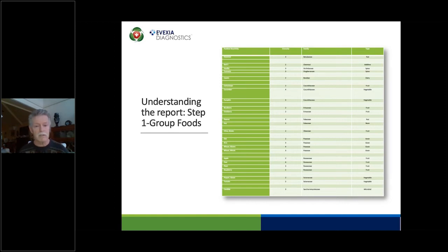And what you'll see universally, I mean virtually across the board, is that a person will take an initial test, they'll test very high positives to certain foods, and they'll also have a lot of symptoms. 10 months, 12 months later, you retest them. What you'll see is the foods in those categories have gone from a 4 to a 2, a 3 to a 1, or a 2 to a negative. So what you see over time is antibodies have a half-life of about 3 to 4 weeks. So antibodies go away as long as you go through the elimination diet and remove the food. So out there 10, 12 months, the antibodies are much lower. But then when you ask the patients via a form, we use a form, and just say, okay, what are your symptoms today versus what were they initially? And uniformly, what you find is antibody titers have gone down, and in general, the symptoms are starting to resolve.